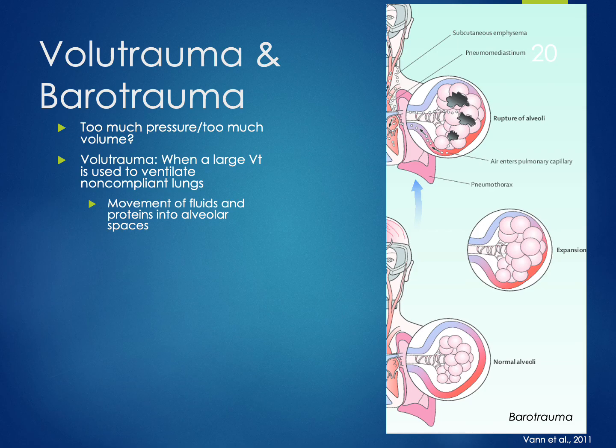And really thinking about all of mechanical ventilation and everything we've been discussing, if we put too much stress on the lungs from this mechanical ventilator and too much stress on the alveoli, overloading the lungs by putting too much pressure on them or forcing too big of a volume of a breath into the lungs, that can cause what's called volutrauma or barotrauma. Now, volutrauma refers to giving a patient with non-compliant lungs too big of a tidal volume, or kind of overstretching them in a sense.